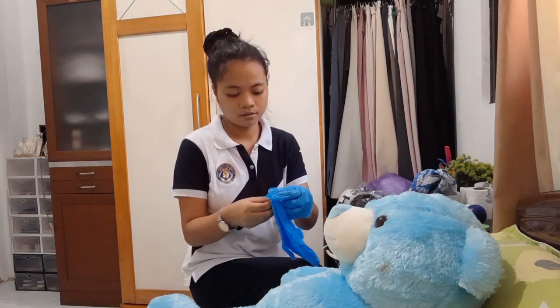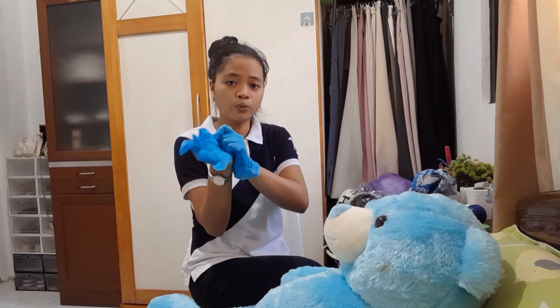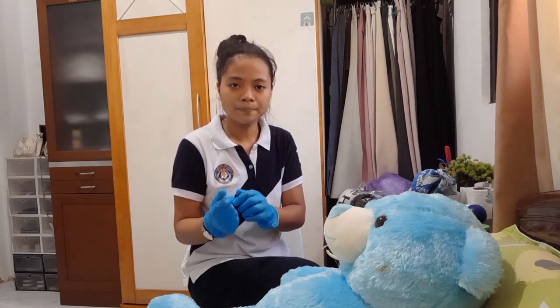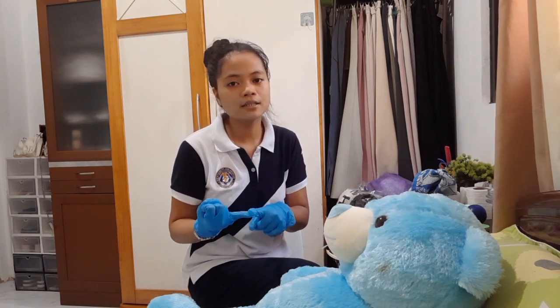Then, prepare the equipment. So, the equipments are personal protective equipment, gastric tube, water-soluble lubricant, stethoscope, pH test strips, more than 35 ml of syringe or catheter for adult, tape, kidney basin, cup with water and straw, safety pin, tongue depressor, clamp, suction canister, suction liner, tubing, 5-in-1 connector, suction feeding pump if needed, and disposable absorbent pad, flashlight or pen light, skin protectant, and lastly is measuring tape.